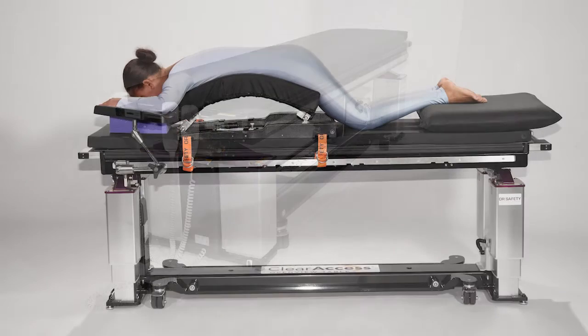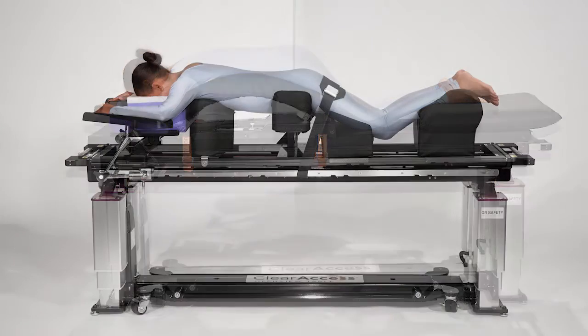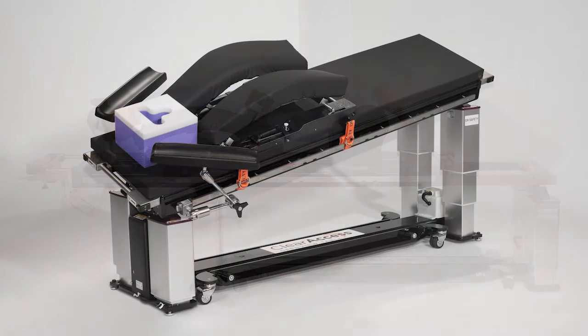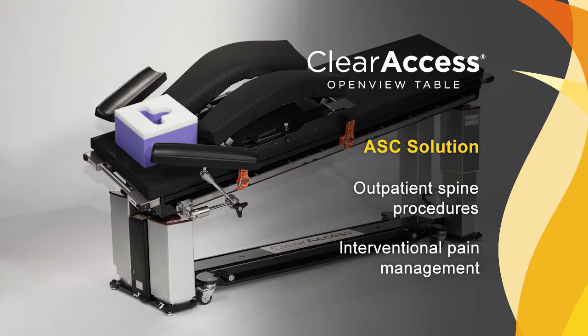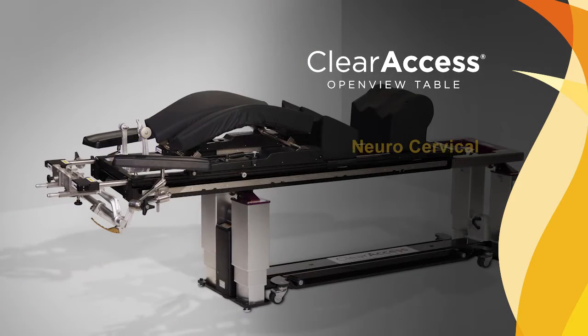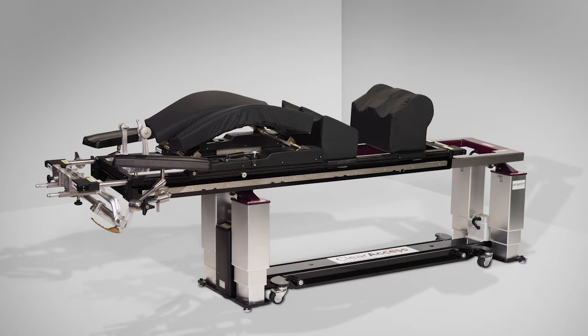The Clear Access Table is the only spine table on the market with three pre-set configurations, each organized in response to customer feedback to deliver the right equipment for specific clinical practices. The ASC solution supports outpatient spine procedures and interventional pain management. The New Standard is configured for hospital-based spine practices supporting anterior, posterior, and lateral spine procedures. The neuro-cervical configuration supports brain surgery and posterior cervical procedures requiring cranial stabilization.